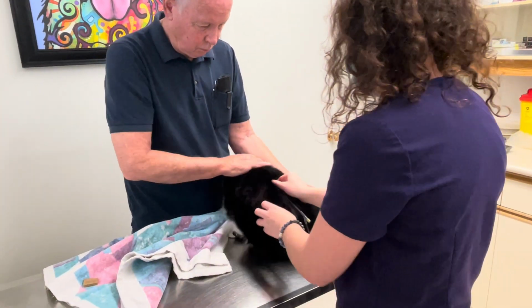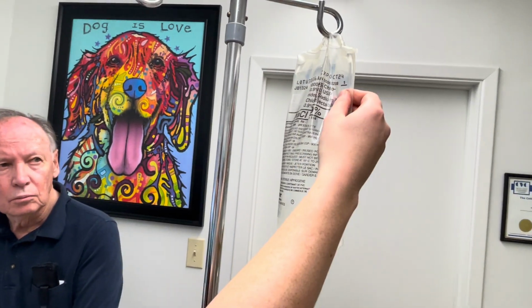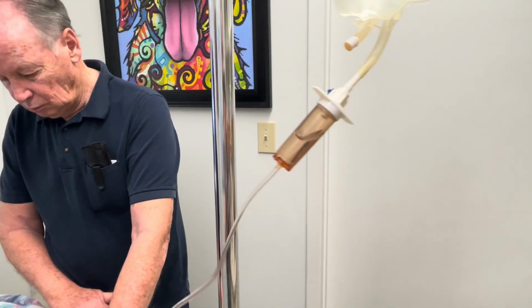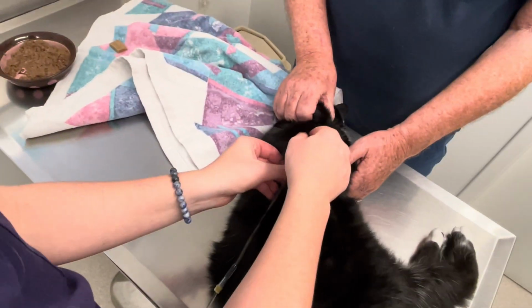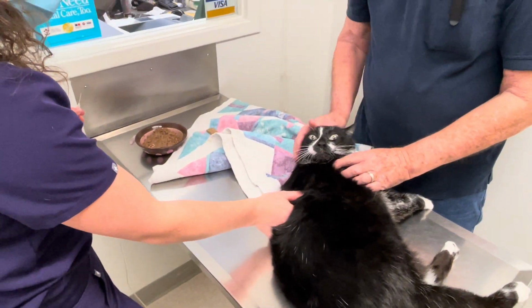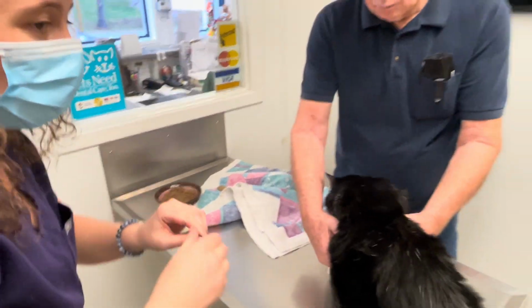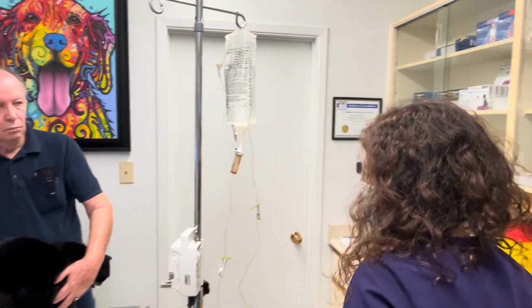And it has been about 10 minutes. So I can look here at my fluids. You can feel the bag. We're really about to that line now, which is where we should be. So I'm gonna turn this off by shutting like this. And then I'm going to pick the skin up here while I come out, like this. Just hold there for a second. And then I just need to aseptically cap. And then we just put the fluids back here again. So we're all set there.